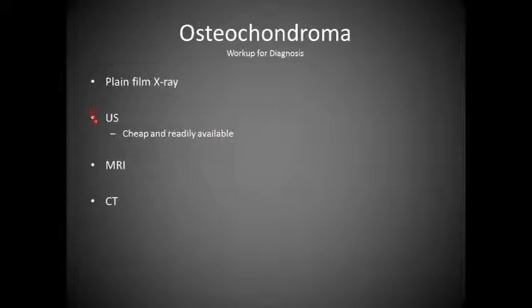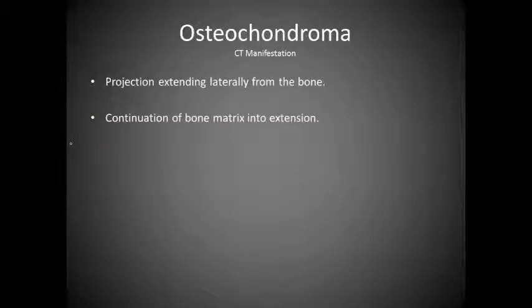However, the problem with ultrasound is that sometimes it's not available depending on where you actually are, what hospital you go to, what time of the day. MRI and CT both can be utilized. MRI provides better differentiation of the soft tissue structures, while CT doesn't. But CT also allows very quick imaging and analysis very rapidly.